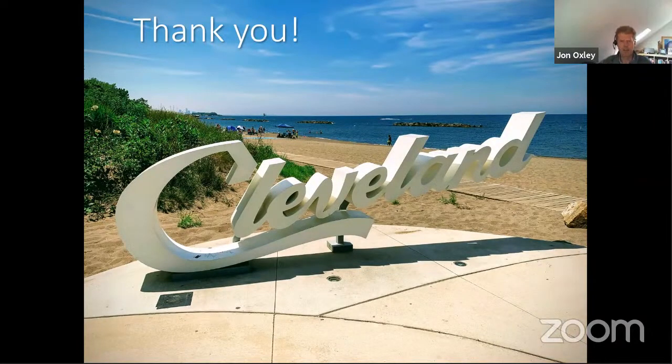This is really thinking outside the box. They ask, in cases of RCC with leiomyomatous stroma, could we consider the lymph node involvement as multifocal tumor rather than metastatic, like we would encounter in an angiomyolipoma?